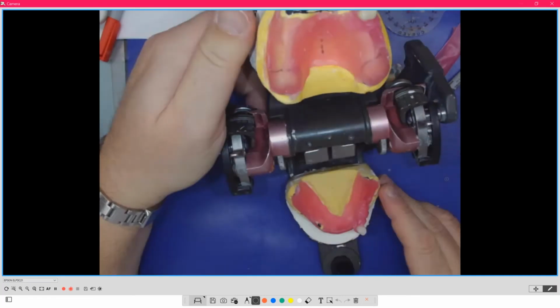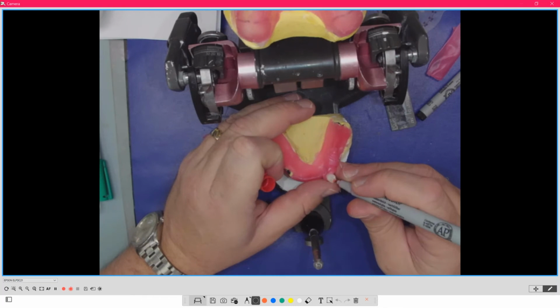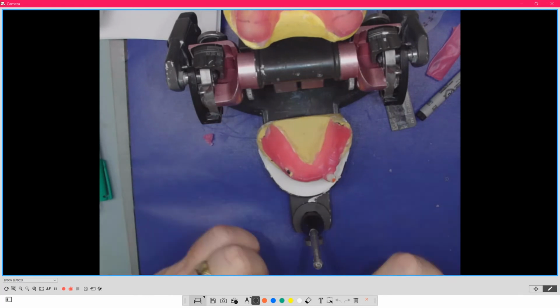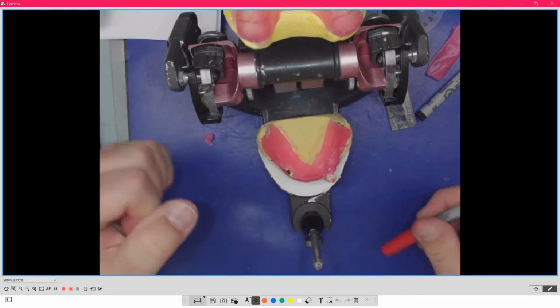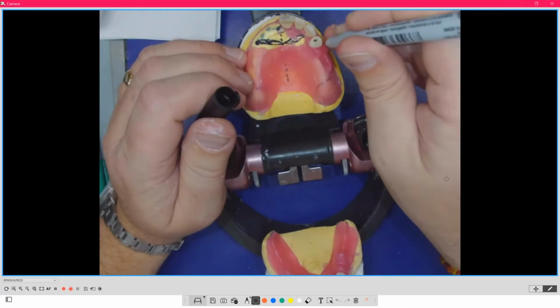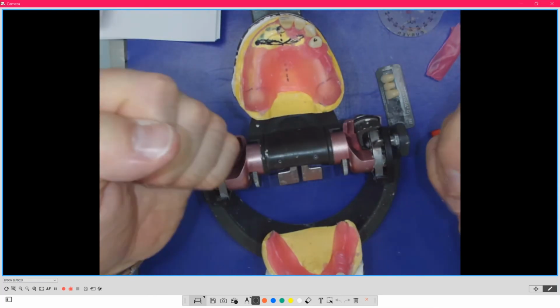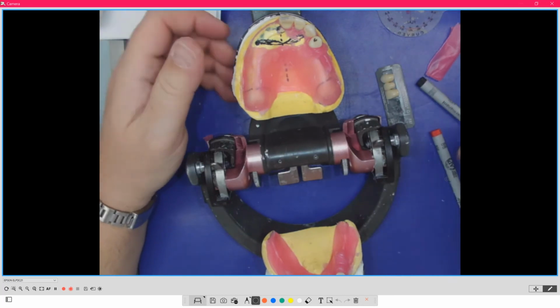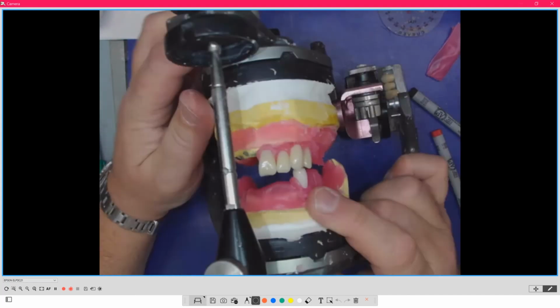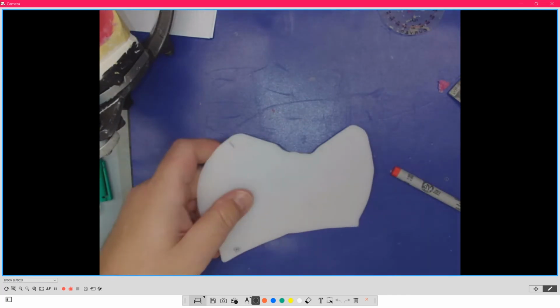Well, I want to show this to you because this is pretty cool. You'll notice this from when I had the drawings of the teeth and where the cutter cusps are. On lingualized occlusion, the first premolar is actually that hammer cusp, and the bowl is actually on the upper. Then it flips over, and all of the lingual cusps are the ones doing the cutting and the lowers are doing the holding, but it's flipped on the first premolar or the first bicuspid only on lingualized occlusion. So let me put this aside so I can use the larger example here.